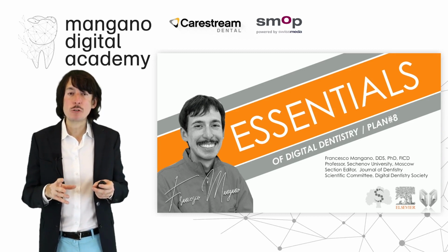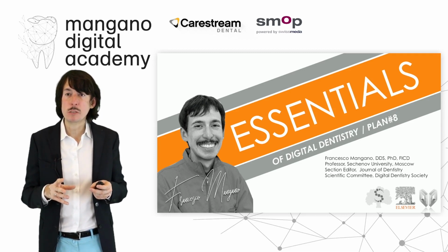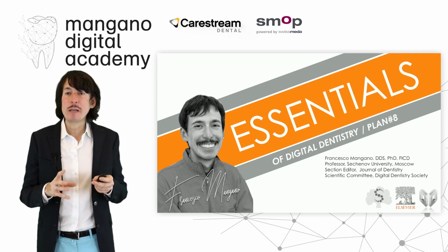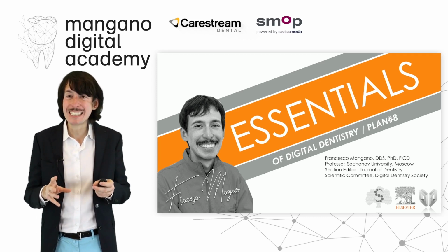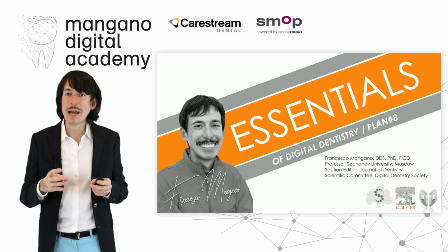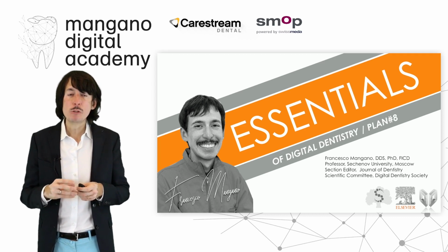In this short lecture, we will talk about implant-supported restoration, in particular about the individual hybrid abutment. In my dental clinic, we have chosen this option for implant-supported restoration in all cases, not only in the anterior cases with highly aesthetic needs, but also for the posterior.